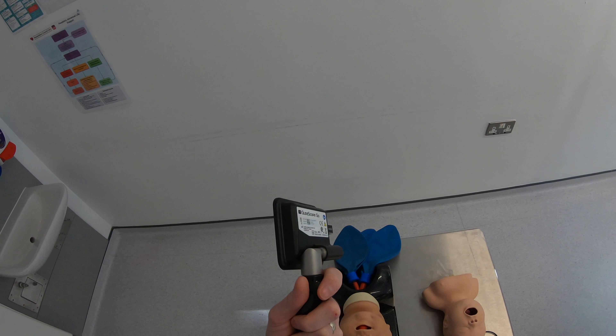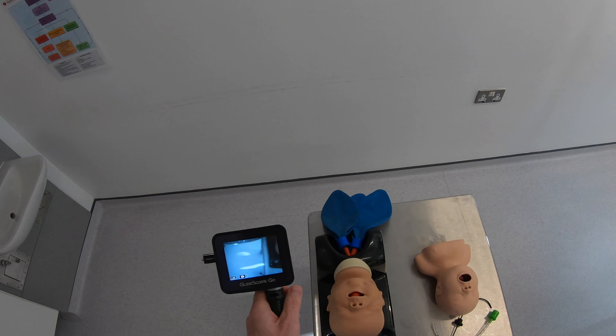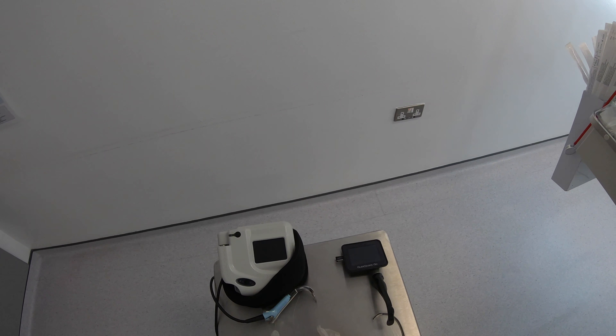It's pretty light and well balanced in the hand, fairly easy to use, and definitely seems to be a nice improvement over the Ranger system. So what I want to do now is compare this to the older Ranger system that it's designed to replace.